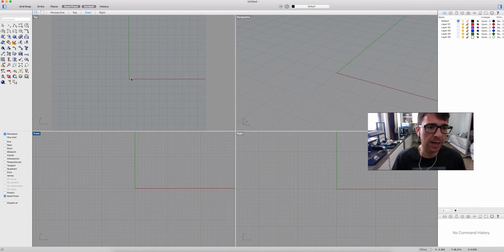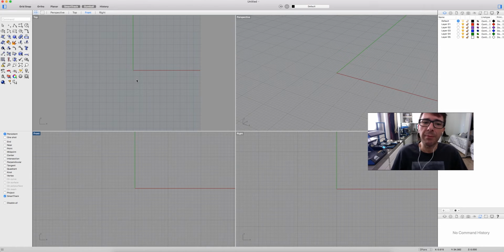But let's start. Here we have opened our CAD software. This will be the same for every CAD software. You can do this on Tinkercad. We can do this on Windows 3D Builder. It's very simple. We have a video showing how to design this. It's a quick video, but we have a video showing how to design this.